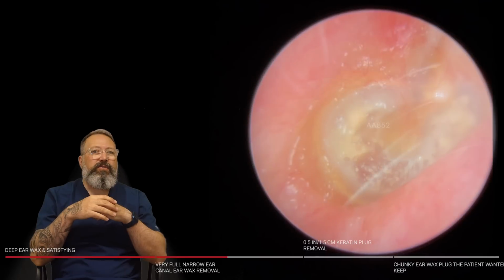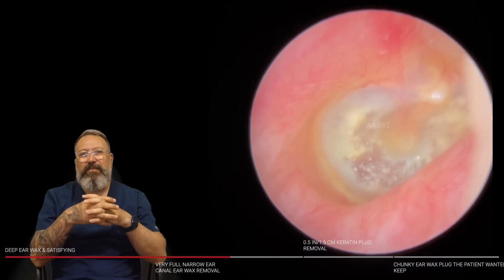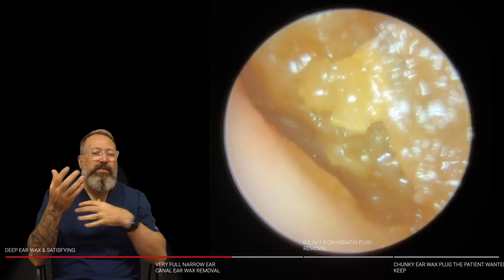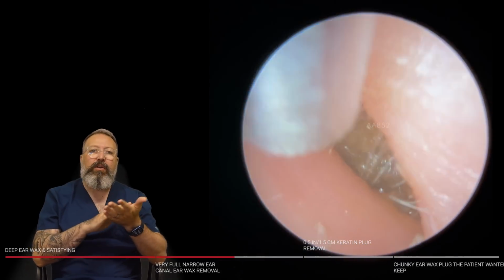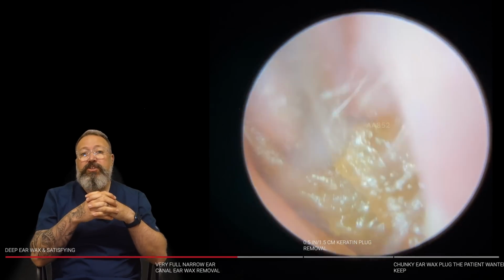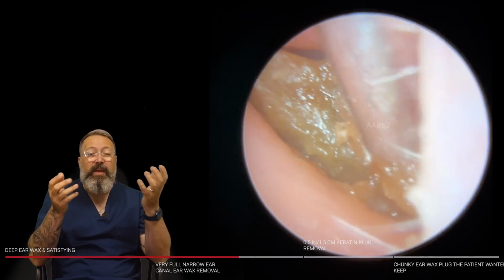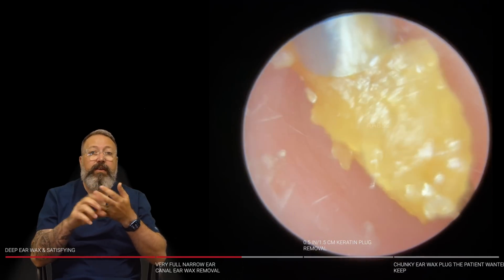Fine end is the smaller of the two tubes that we use here in clinic as well. So the eardrum has quite a mottled appearance to it, but it's had all this stuck in the canal for a little while. You do get a bit of tympanosclerosis as well as we get a bit older. Tympanosclerosis is where you see that greying or cloudy patches on the eardrum, not necessarily an indication of an unhealthy eardrum. It's quite common with age. If you suffered with ear infections when you were younger, that kind of thing can have an impact on it as well.